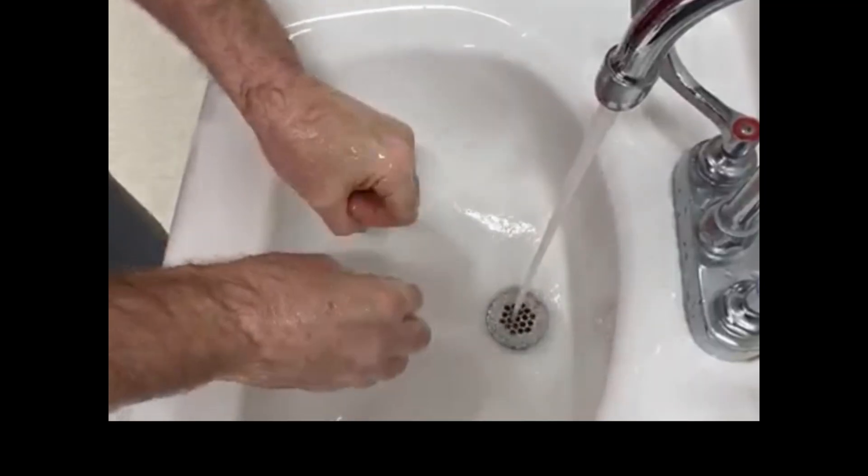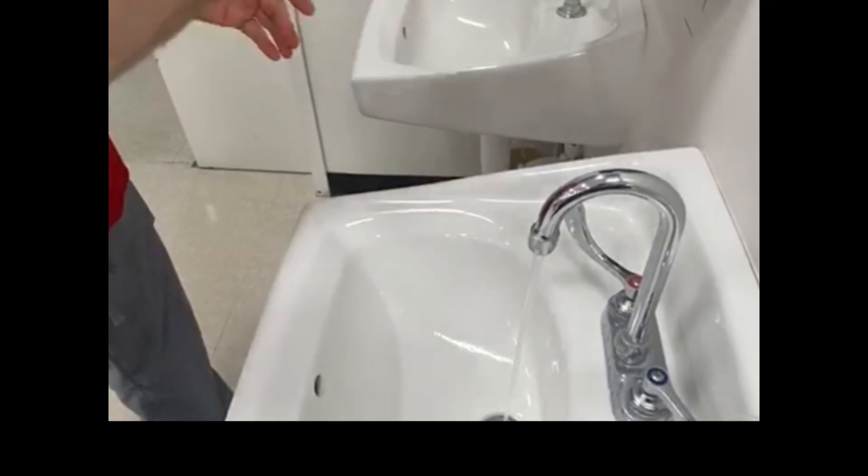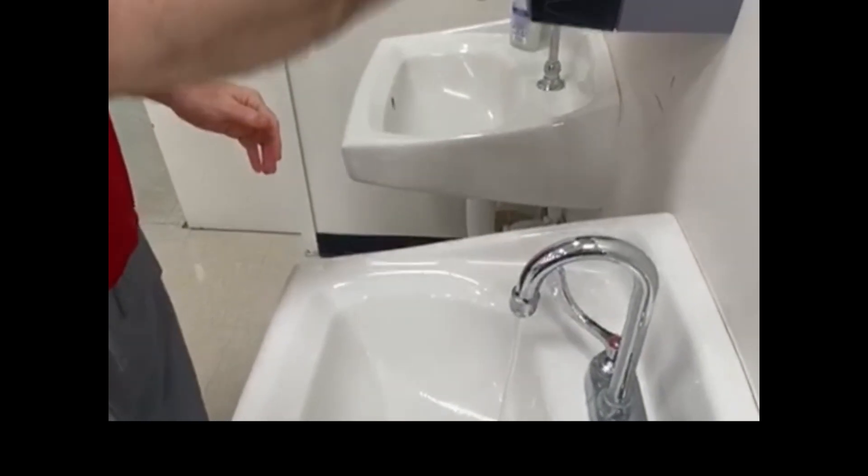Rinse hands and dry thoroughly with clean paper towels. Hand-operated faucet handles must be turned off with a clean, dry paper towel.